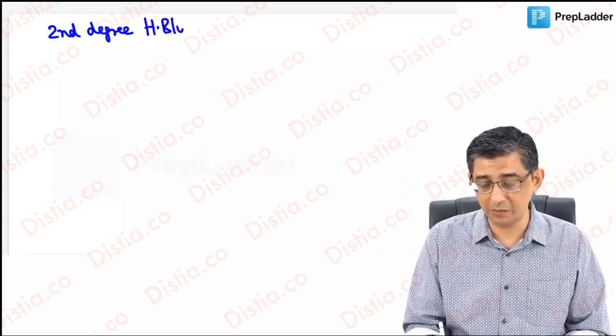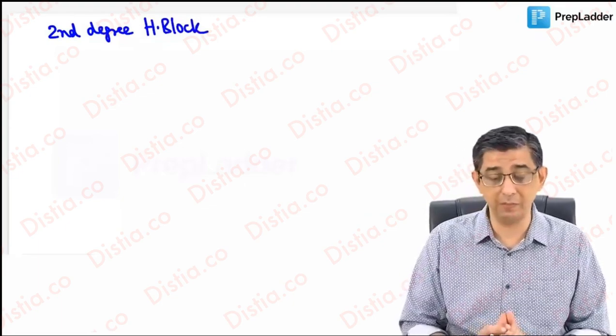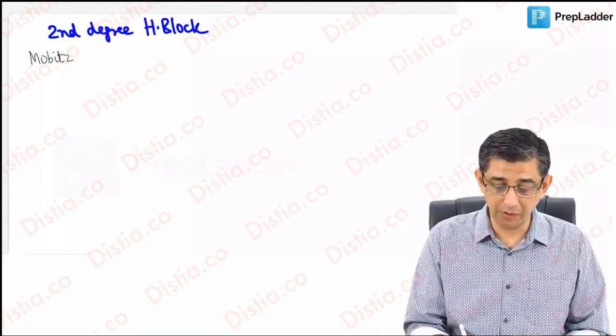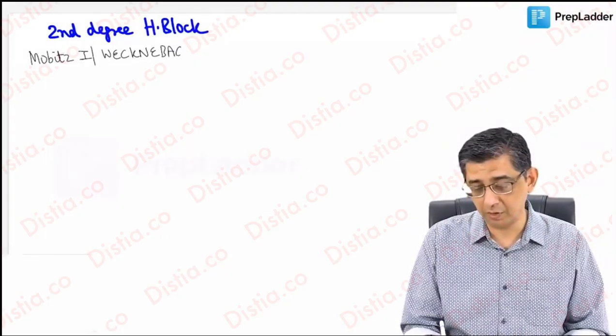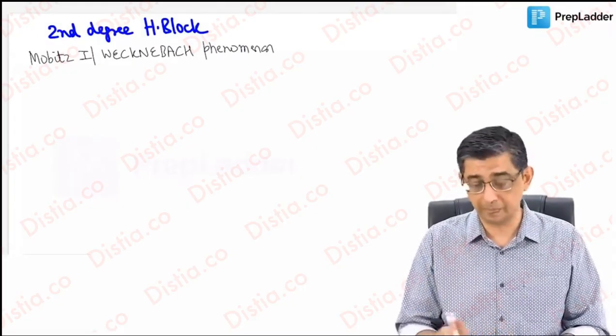So I'll hand draw the ECG before you to actually explain how the manifestations in these patients will develop. Please remember that a lot of times in the multiple choice question, instead of writing the traditional Mobitz 1, they would love to ask this longish technical name, that is Wenckebach phenomenon as well. Let's now understand how this Wenckebach phenomenon will evolve in the patient. I mean, where is the problem?